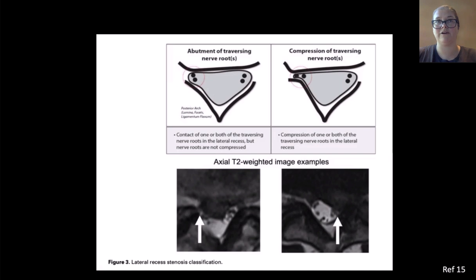I think it's important for us not to overestimate or underestimate the patient's symptoms. That was an interesting point that Yusuf said in one of his lectures, that things probably look a little bit different. So just keep that in mind for the clinician's description of the symptoms. Sometimes I think, why am I not seeing a bigger disc there? Maybe that's part of the reason: they're supine, there's no axial load.